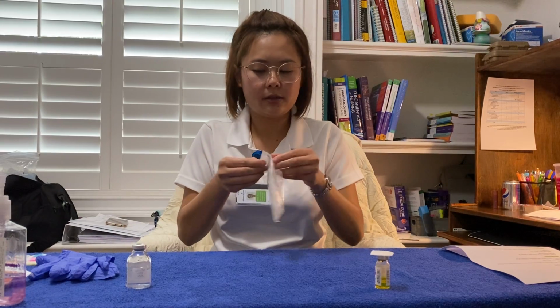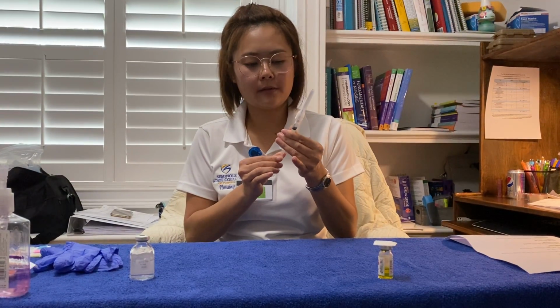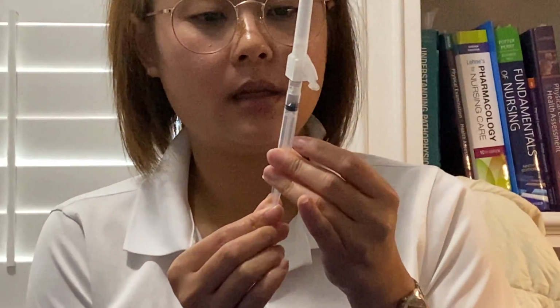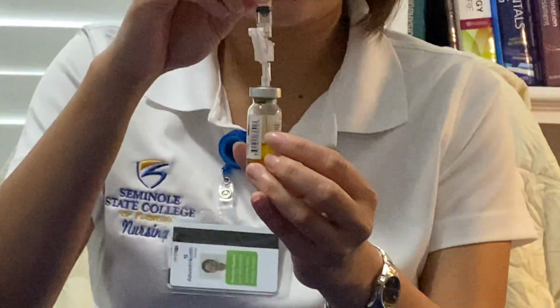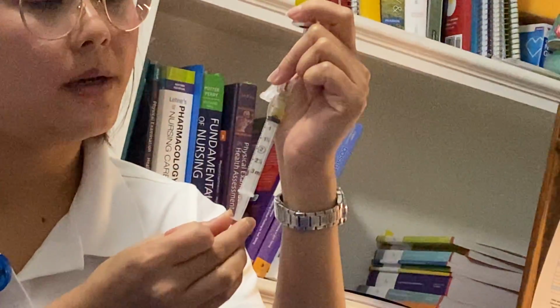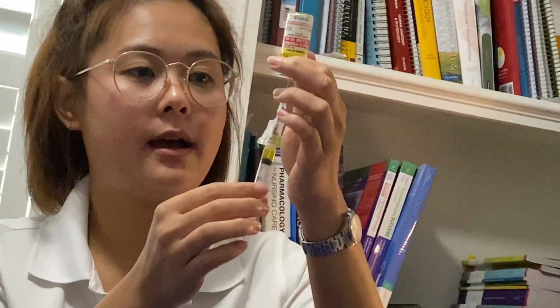Alright, I'm going to use my 3 ml, 22 gauge syringe. Attach it, and then exercise the plunger for a little bit, and then pull back 0.5 ml as prescribed. Then carefully inject the air inside the vial, where all the air is on the top, not in the solution. Then invert the vial and pull back 0.5 ml. You can pull back more than that and then put it back, but make sure that you get 0.5 ml. And if you have bubbles, make sure you don't have bubbles inside. So I don't have any bubbles.